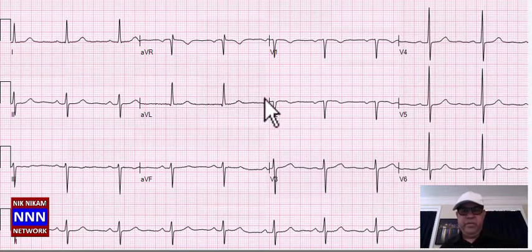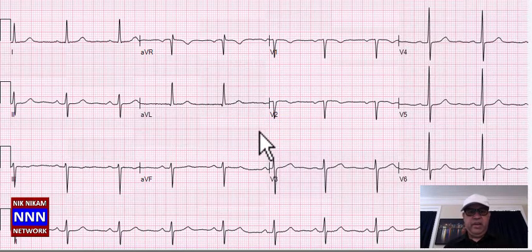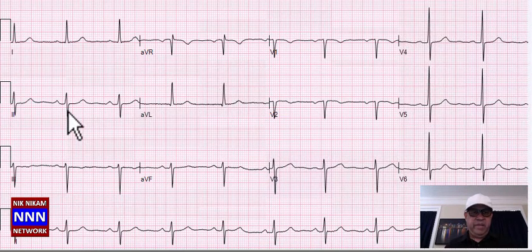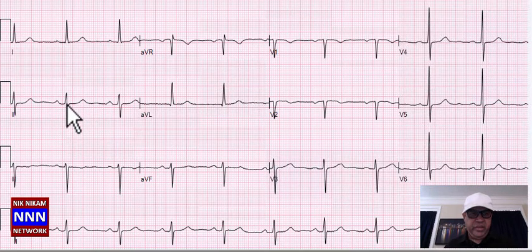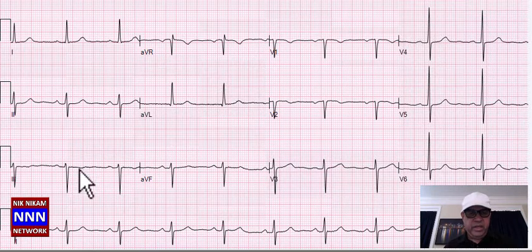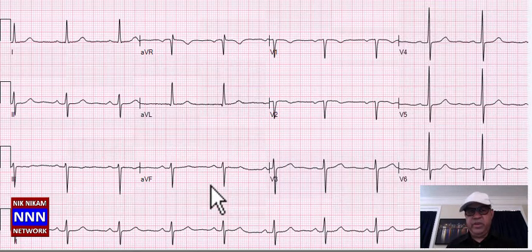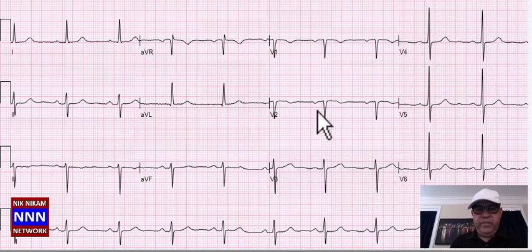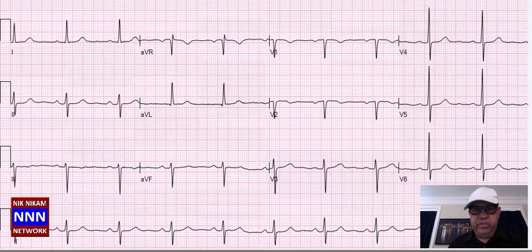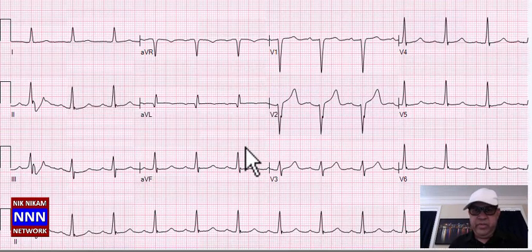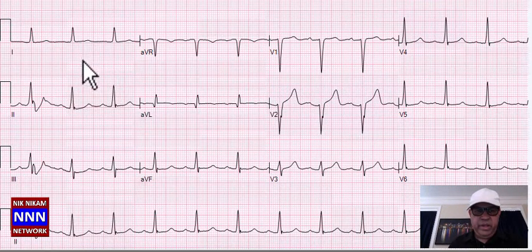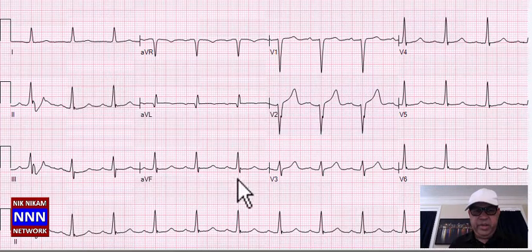Here's a sinus rhythm with nothing really spectacular, but there is left axis deviation because the negative deflection is greater than the positive deflection in lead 2, leading to left axis deviation. There is also left anterior hemiblock — a conduction problem — but no significant ischemia or findings beyond that.